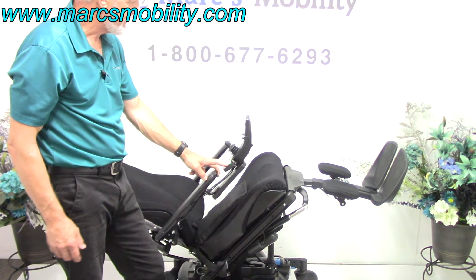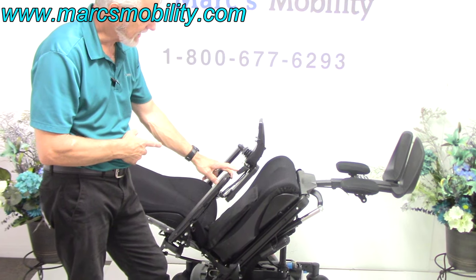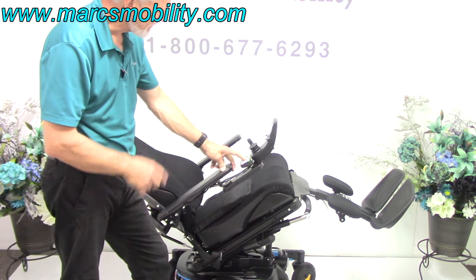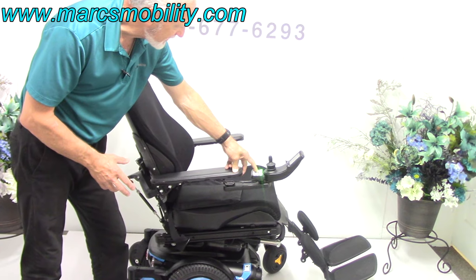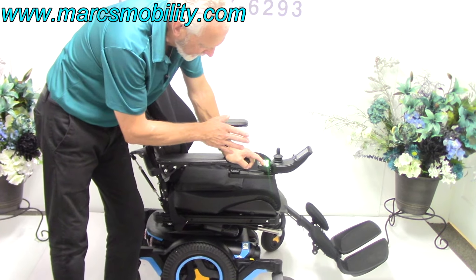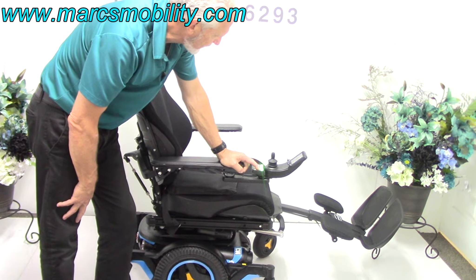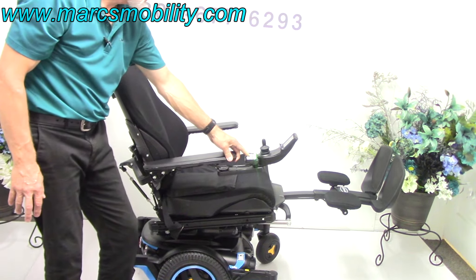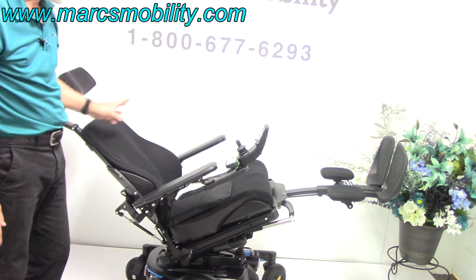The next option is the electric legs. If you want your legs higher than your body, you can elevate them. With these M3s, you have to elevate the legs before the seat is tilted. I'll bring the seat back down, then bring the legs up. These legs are adjustable — whether you're five feet tall or six foot three, we can adjust the length. Once the legs are up, you can then do the electric tilt and have your legs straight out higher than your body.